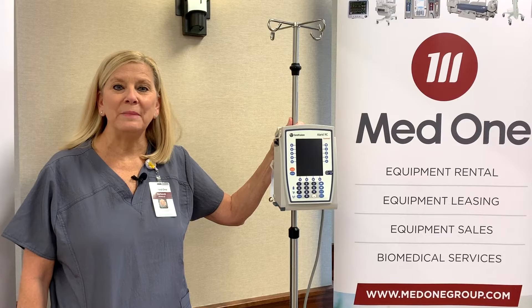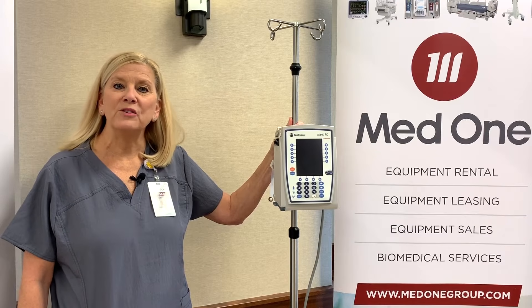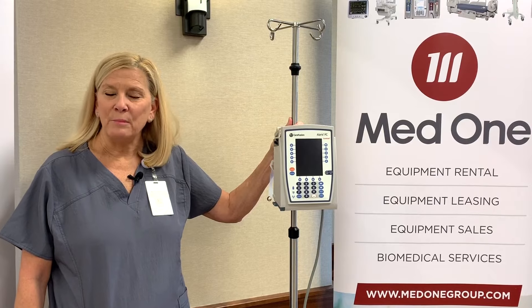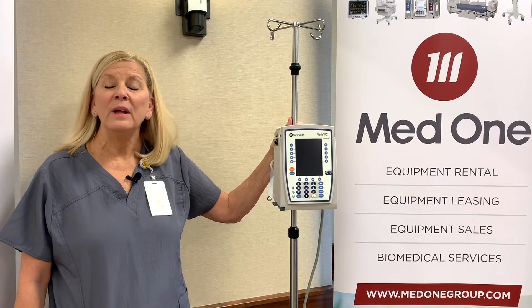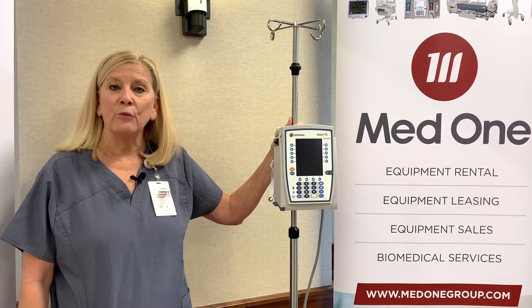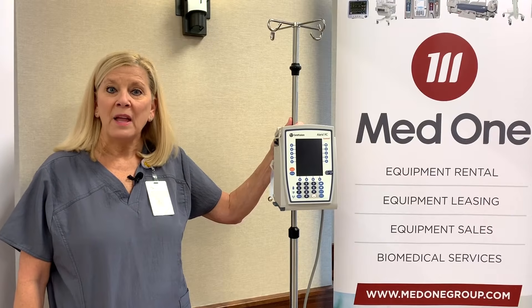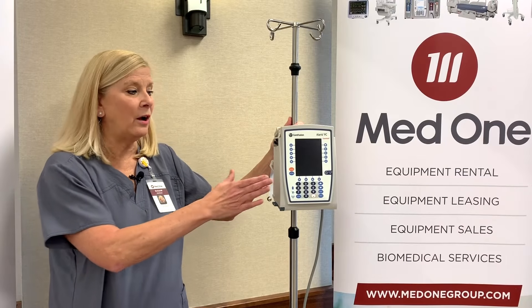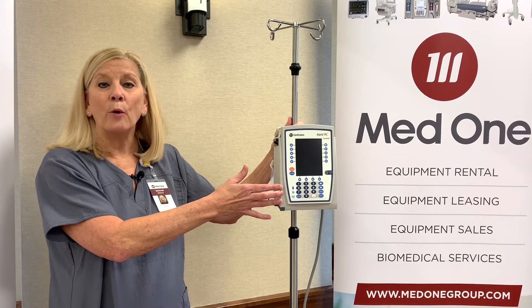Hi, everyone. My name is Susan Mingle. I'm a clinical specialist educator for MedOne Group. I'm happy to be here today. My purpose today is to show you the Alaris Point of Care Unit and the PCA module that you've recently acquired for use. I'd like to start with an overview of what we call the Point of Care Unit, or PCU.